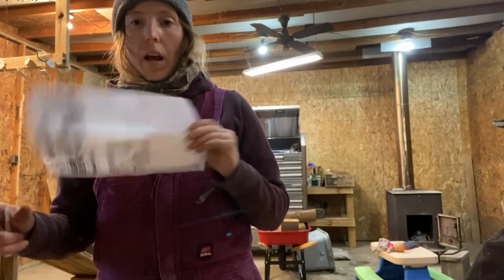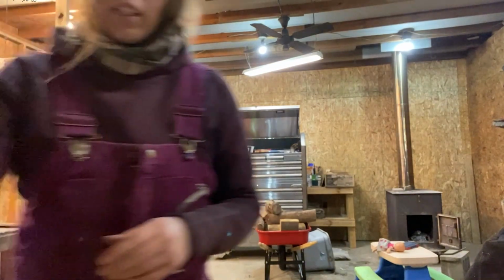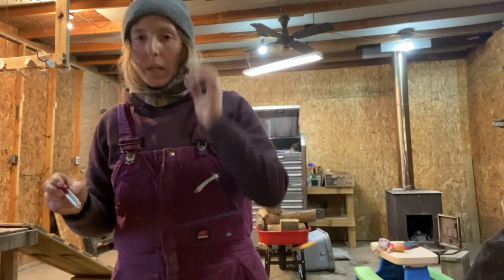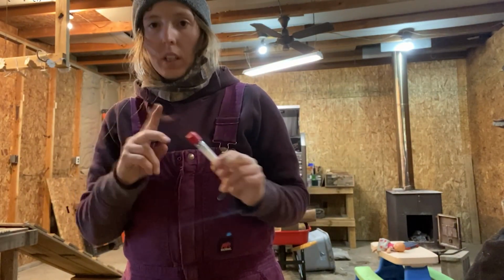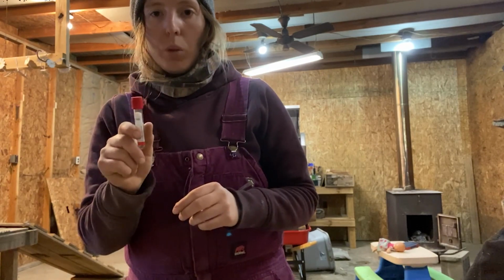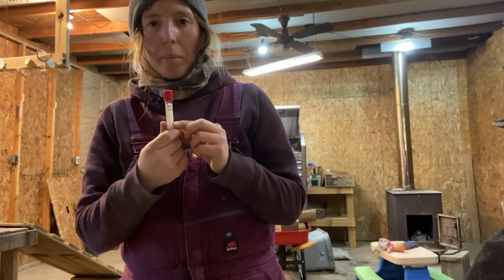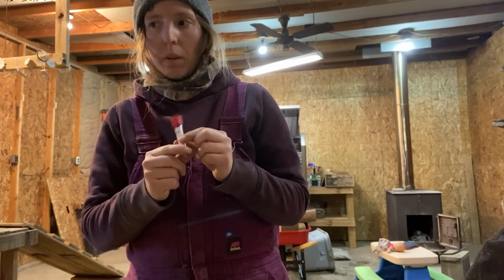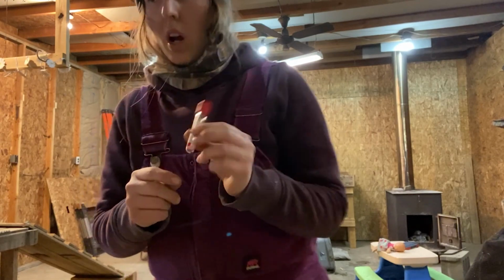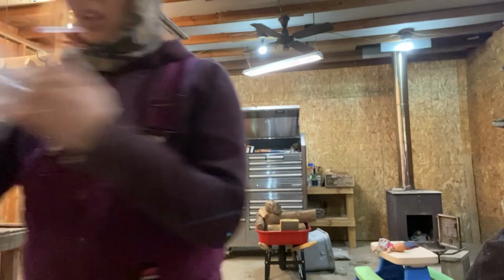So I have my form filled out, and then I went ahead and labeled all my test tubes ahead of time. Now again, every lab has different requirements. There are different ways that you can do this. For the test I'm running, a red top tube is the kind of tube they want. I think there's one other one you could use, but I buy these red top tubes in bulk. They're not too expensive, maybe $25 or $30 for a big case of them that looks like this here.